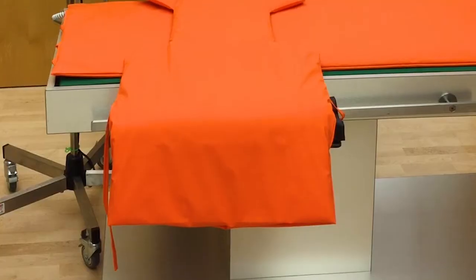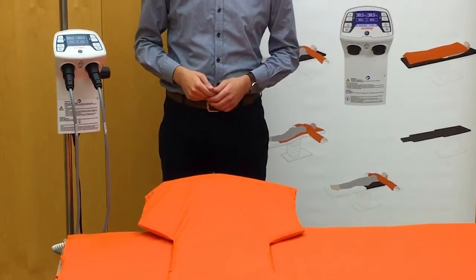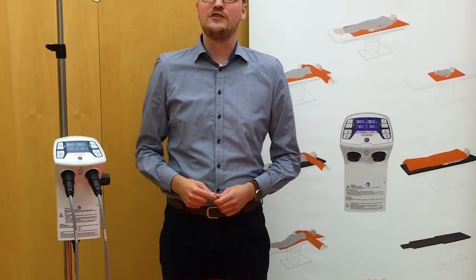Hello and welcome to our instruction video for the Astopad Resistive Patient Warming System. The Astopad is a resistive reusable patient warming system that is safe and simple to operate. It helps prevent and treat hypothermia through the perioperative journey for all surgical patients. Our goal is to keep the patient normothermic through the perioperative process, which will help ensure a positive patient outcome.